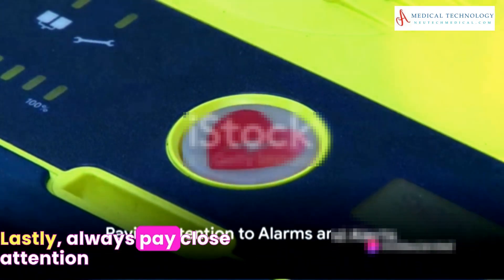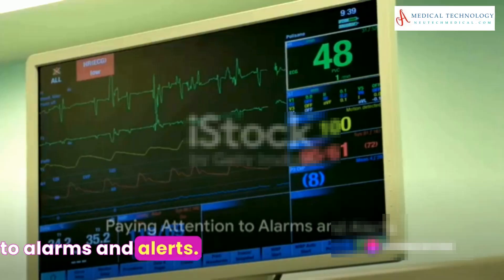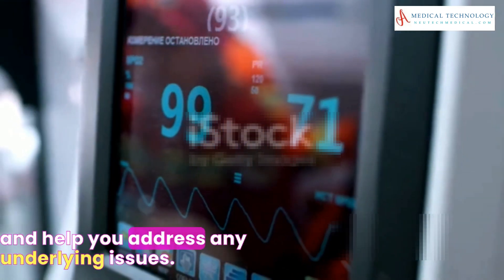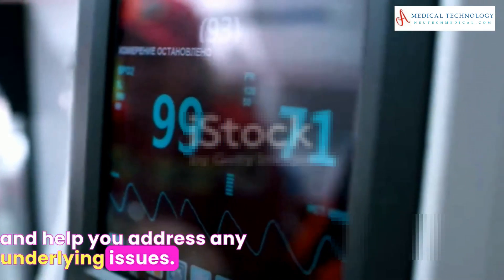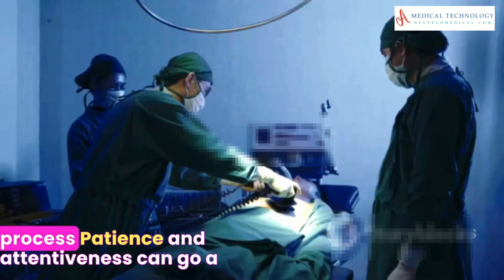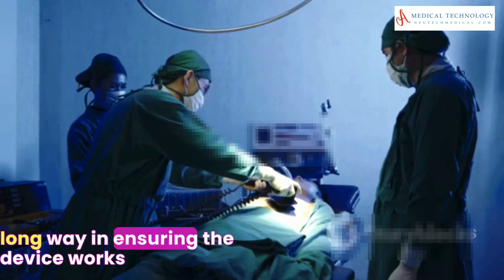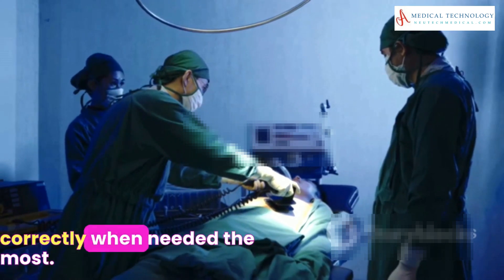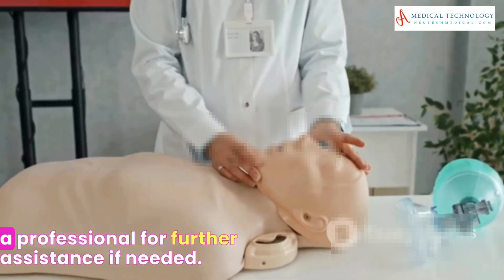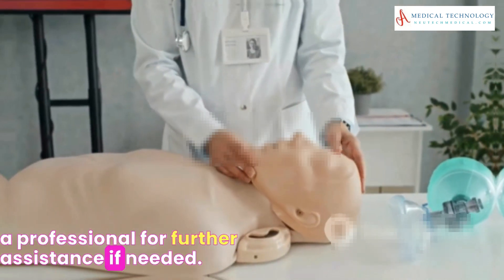Lastly, always pay close attention to alarms and alerts. These notifications are there to guide you and help you address any underlying issues. Remember, troubleshooting a defibrillator is a systematic process. Patience and attentiveness can go a long way in ensuring the device works correctly when needed the most. Always consult your user manual or contact a professional for further assistance if needed.